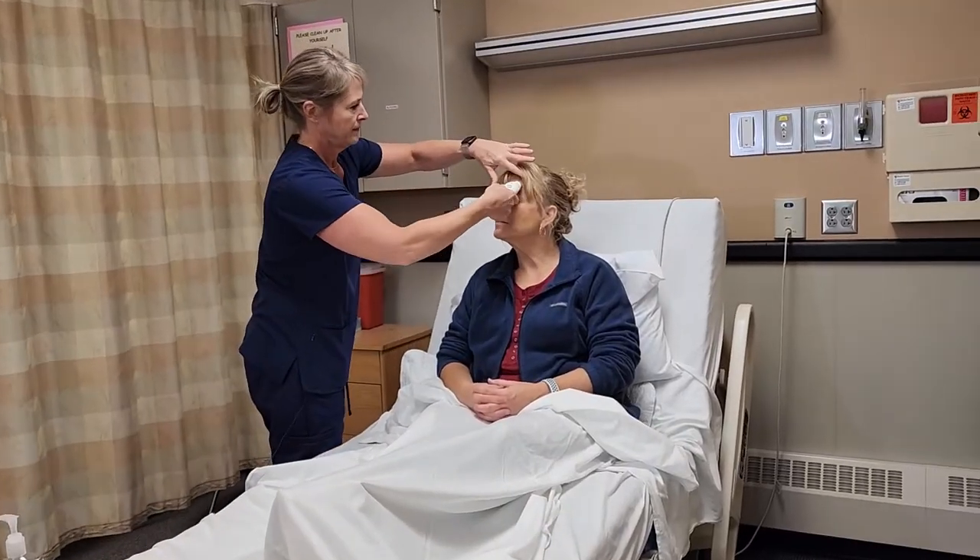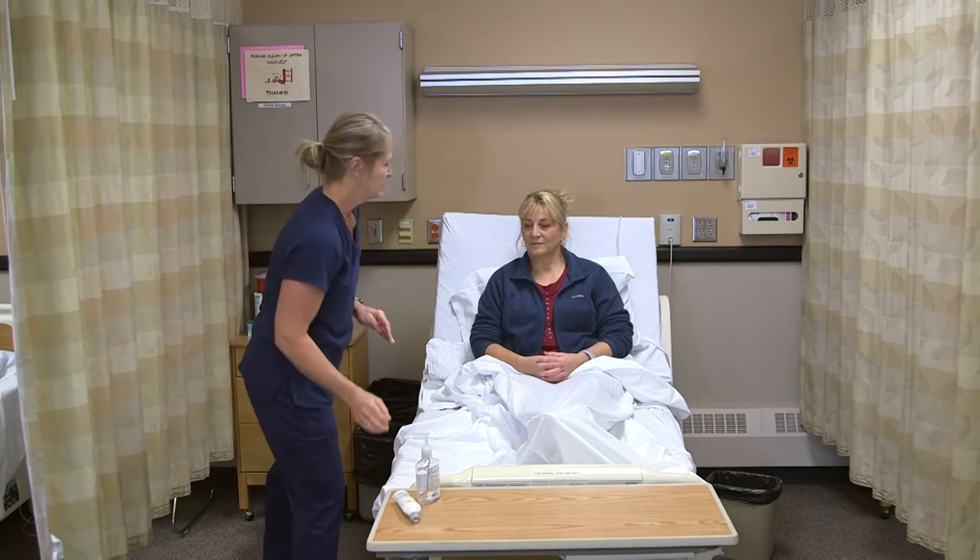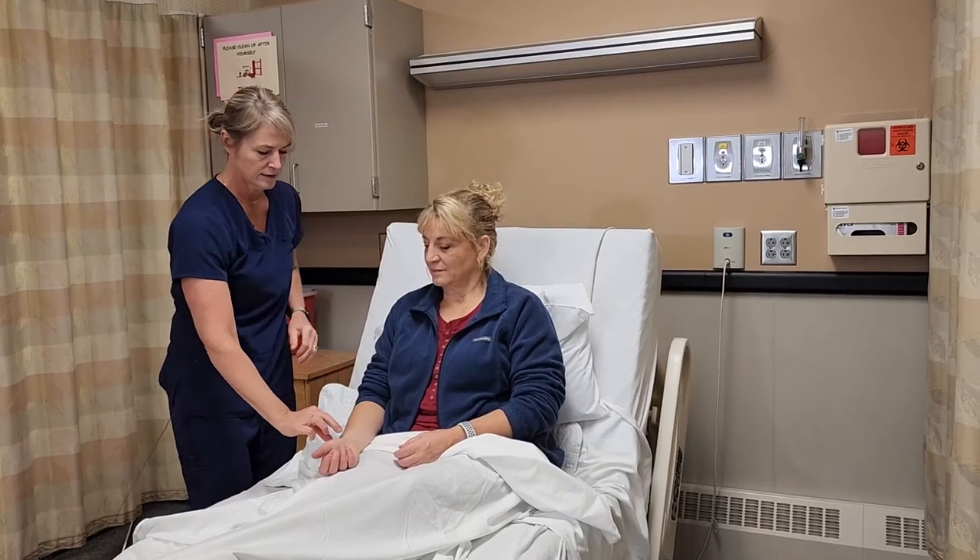The thermometer is just going to glide right along the skin. The reading comes back 98.8 degrees Fahrenheit. Now I'm going to take the pulse.